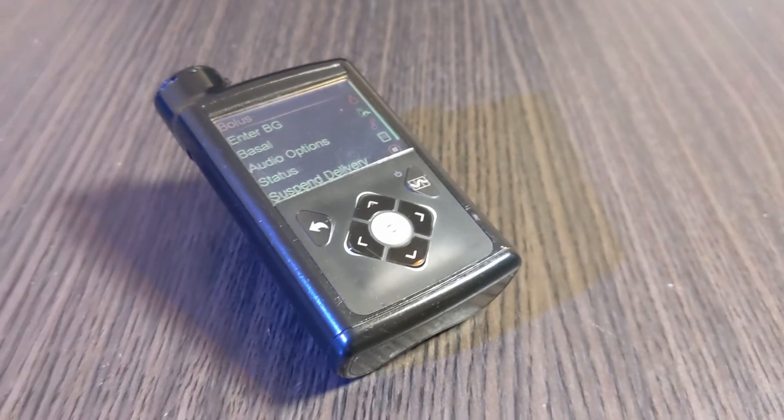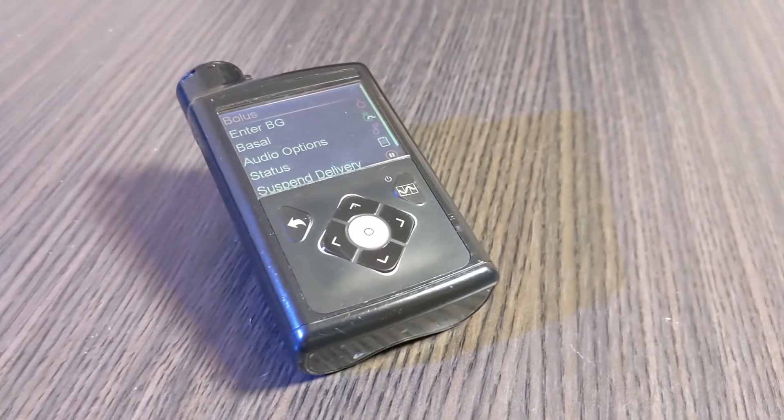Hey, my name is Eric, and today we are talking about the MiniMed 670G system from Medtronic.